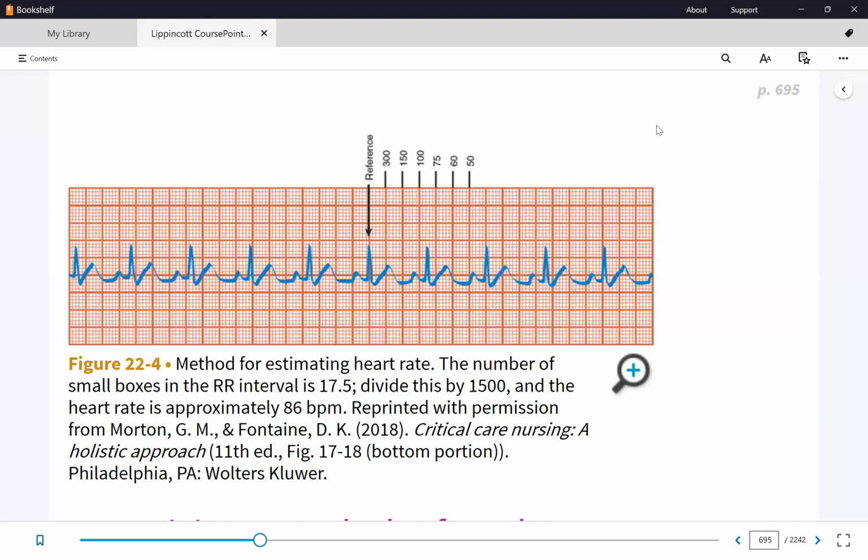Okay, you agree? Yes. One more time. Where did you get that one? Okay, so I established my 3-second markers. 3-second marker, 3-second marker. I did not count this initially because it's an incomplete heartbeat. So I counted 1, 2, 3, 4, 5, 6, 7, 8. I should not really count this because it's incomplete, yeah?